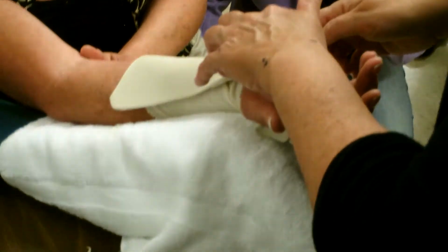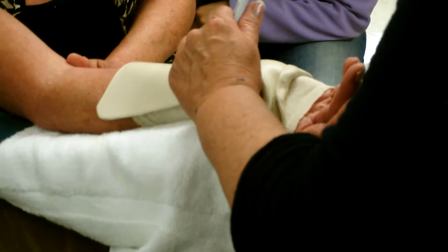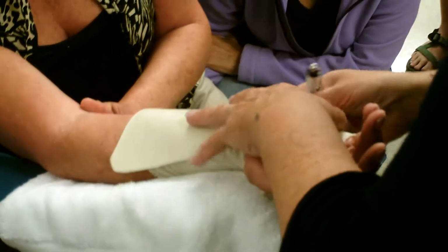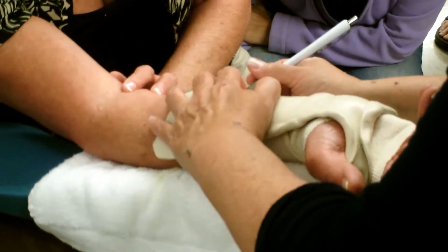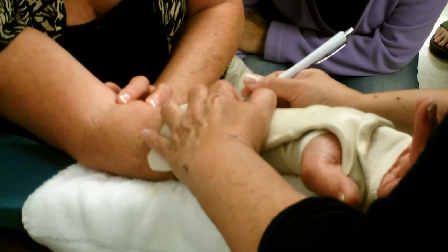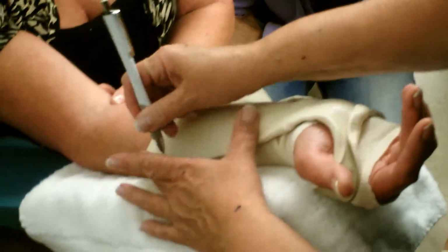All right, so sometimes this isn't beautiful because of my little mess up here. I would never do that with a patient. I would start over with a patient. Before I get it off the patient, I'll check, does this look like it's going to work? Let me mark for straps. Typically we want like a 2-inch. I'm probably driving her crazy because I put pen marks on the splint.